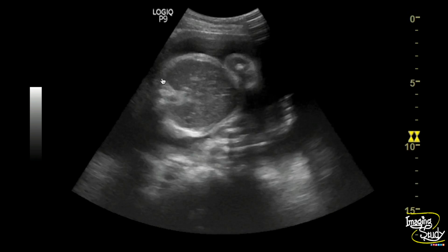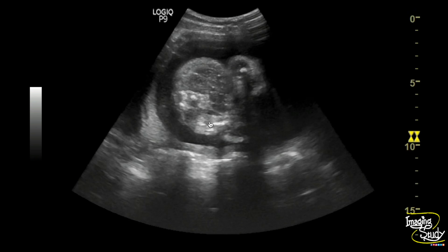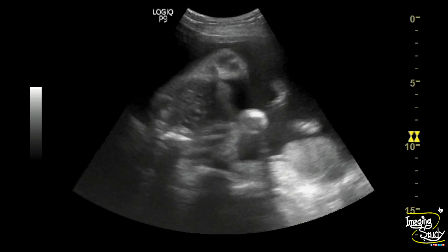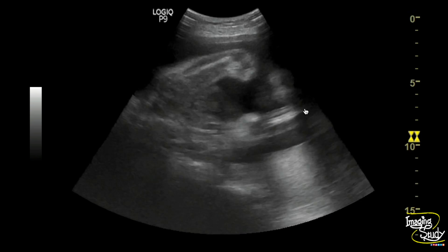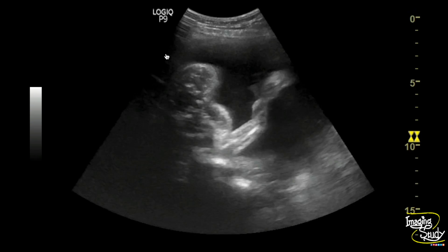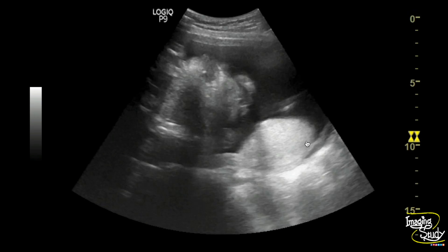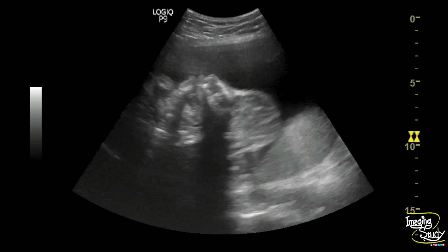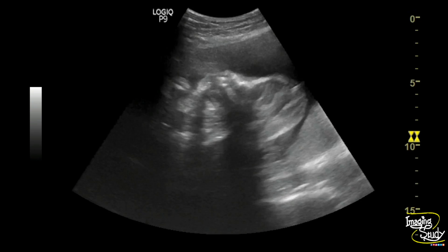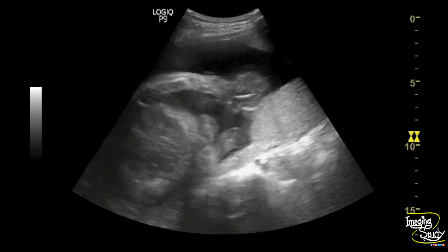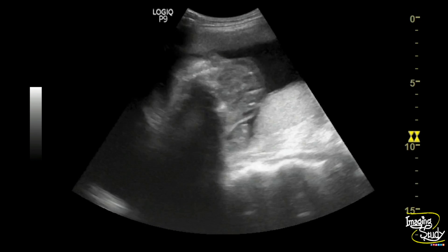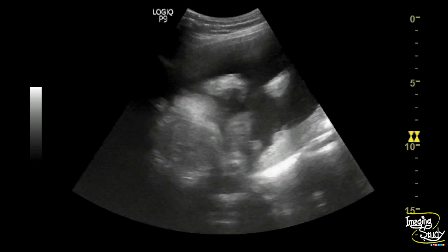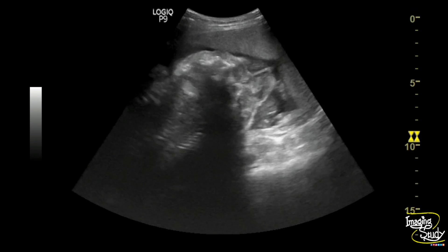Now when you come to the fetal chest and abdomen, you can see no cardiac activity. So this is actually a dead fetus. At this age the amniotic fluid looks quite increased — it's a dead fetus and should have oligohydramnios, whereas here we can see it's having increased amount of fluid, that is polyhydramnios, which is common in neural tube defects due to poor swallowing. So this is a case of dead fetus due to anencephaly.